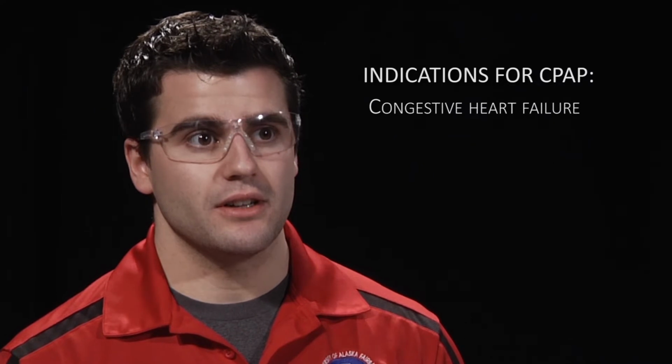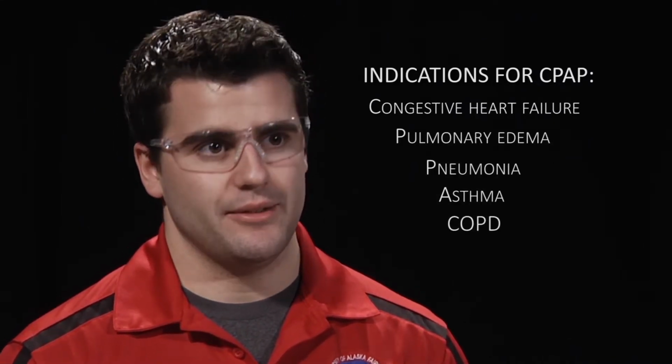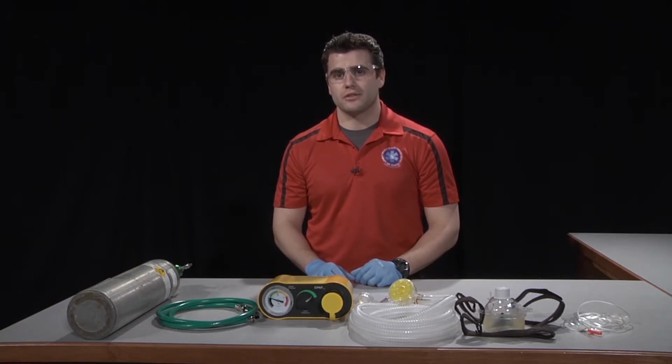From there, we're going to look for our indications for CPAP. Our indications are congestive heart failure, pulmonary edema, pneumonia, asthma, and COPD. After assessing for indications for CPAP, we're now going to assess for contraindications.